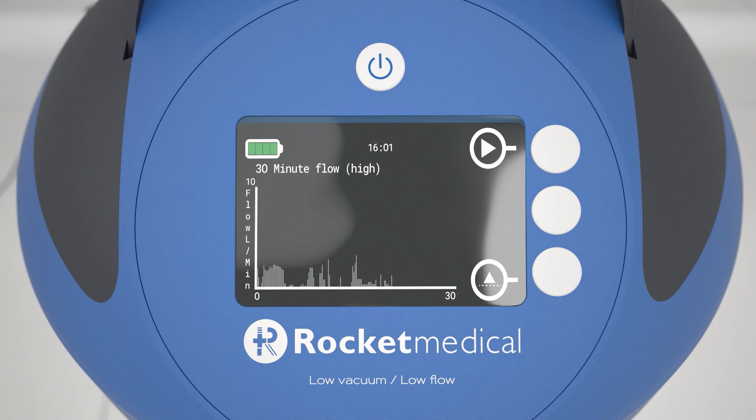The three display options show: 30 minute high flow, where flow is measured up to 10 liters per minute; 30 minute flow, where flow is measured from 0.5 liters per minute; and the previous minute's flow, where flow is measured from 0.18 liters per minute.